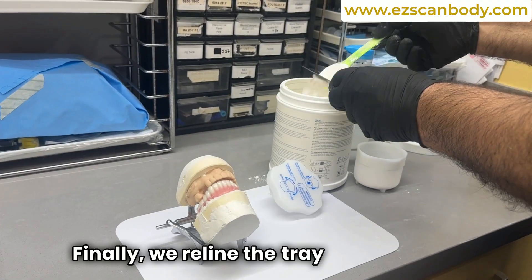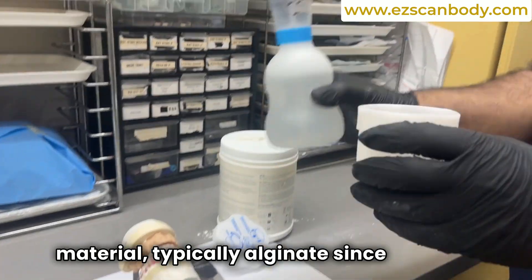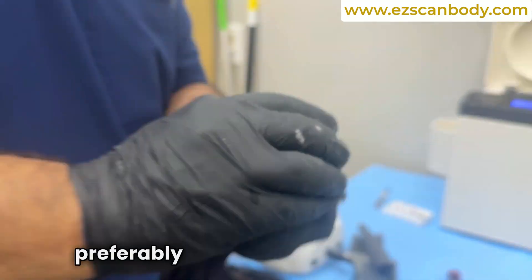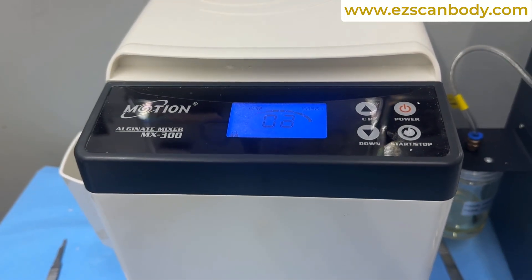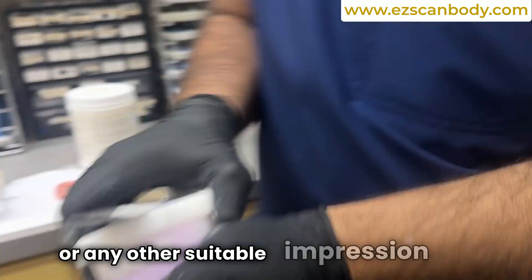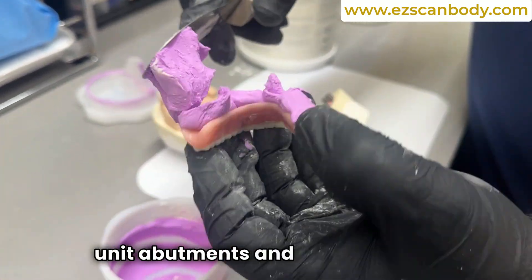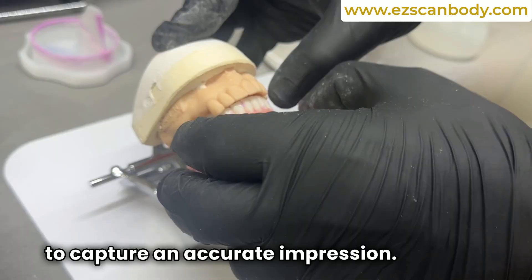We reline the tray with the appropriate impression material, typically alginate since it doesn't stick to the stitches. Mix the alginate according to the manufacturer's instructions, preferably using an alginate machine for consistency. Once mixed, place the alginate or any other suitable impression material into the denture. Position the denture over the multi-unit abutments and have the patient bite down properly to capture an accurate impression.